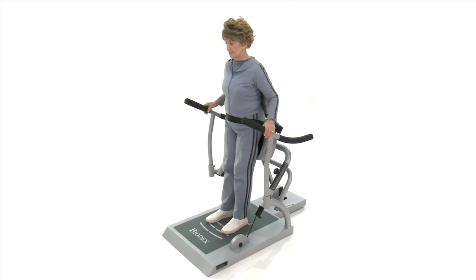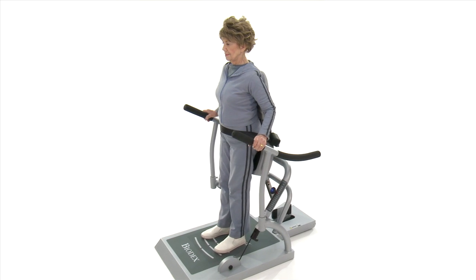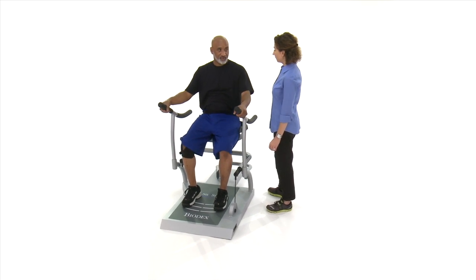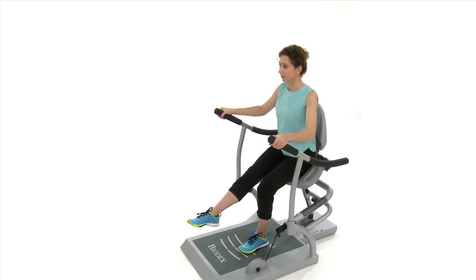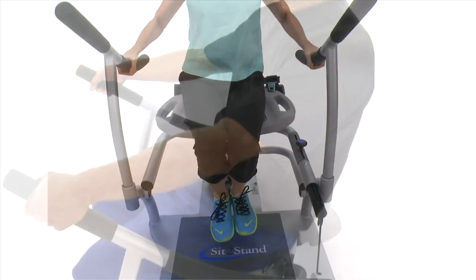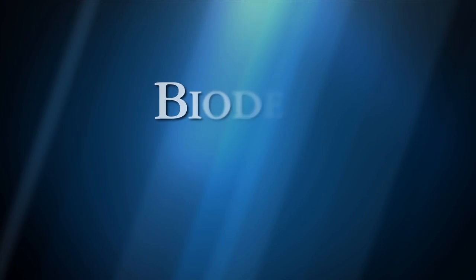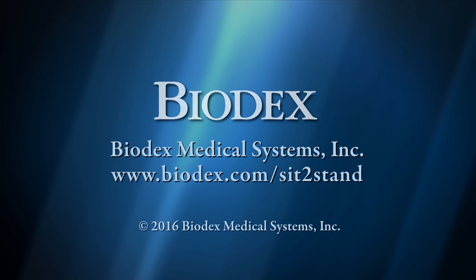The Biodex sit-to-stand trainer can provide benefit to just about everyone — specifically those looking to gain or maintain independence, orthopedic patients, neurologic patients, those needing physical or occupational therapy, and older adult fitness and wellness environments. The Biodex sit-to-stand trainer can give your practice or wellness center the clinical advantage. Call Biodex or visit biodex.com today to learn how you can repair the first link in the mobility chain.